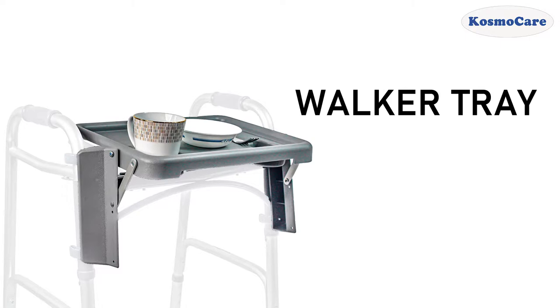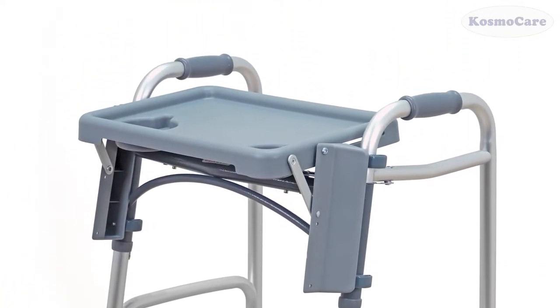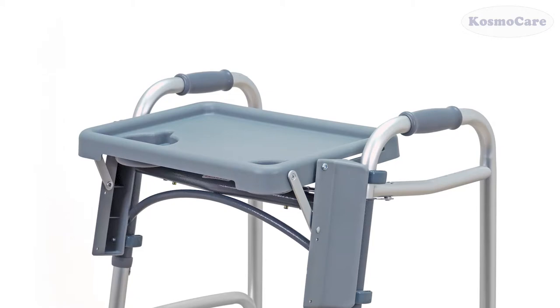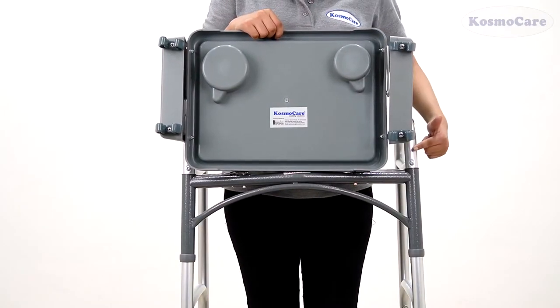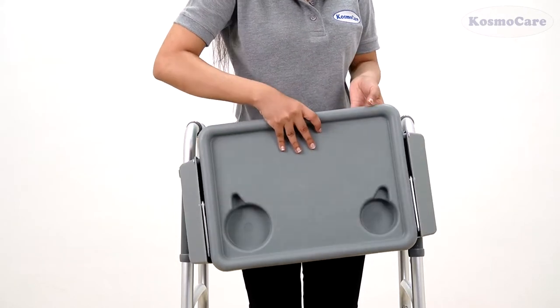The CosmoCare walker tray is designed to assist you to carry food, beverages, or any other object while using your folding walker. The tray has four brackets to securely attach to the walker, and it is compatible with most walkers.